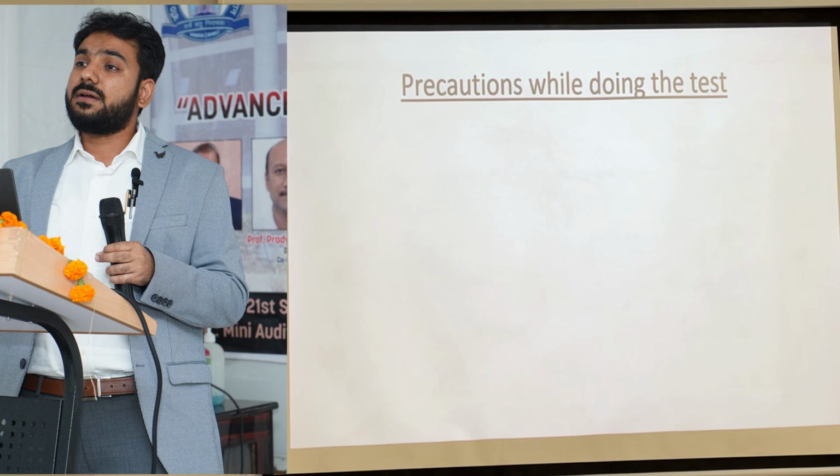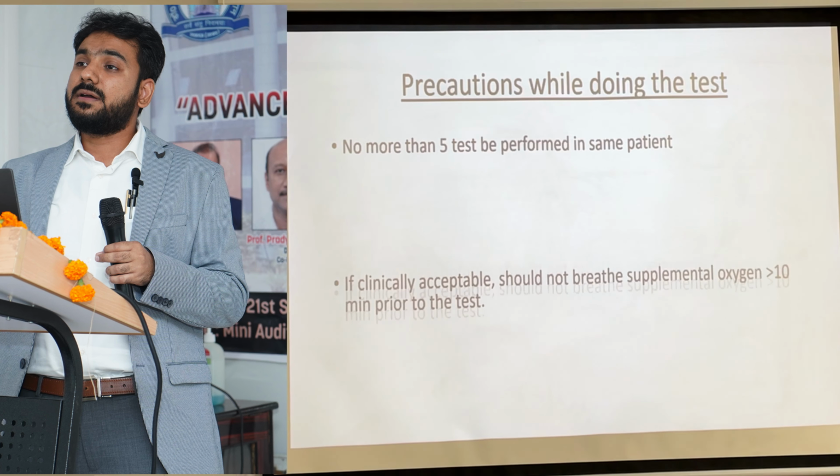Well, now what are the precautions that we should take while doing this test in a patient? No more than 5 tests should be performed in the same patient, because we are asking the patient to inhale CO. Although we are using non-toxic levels, if we ask them to repeat the test again and again, it might lead to dangerous levels of carboxyhemoglobin in his blood.